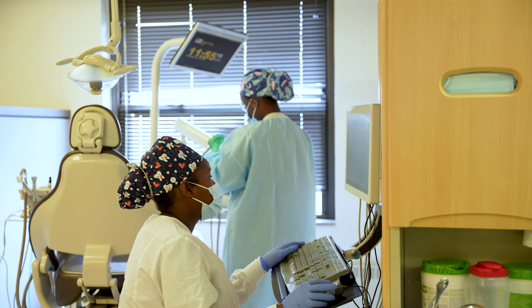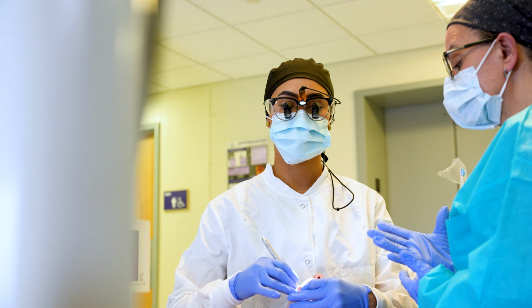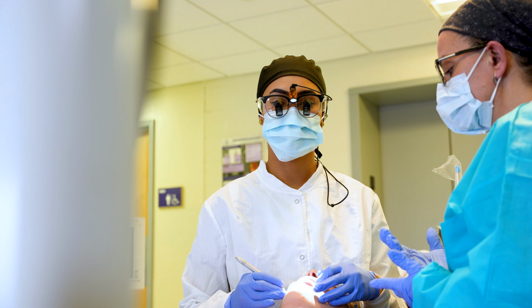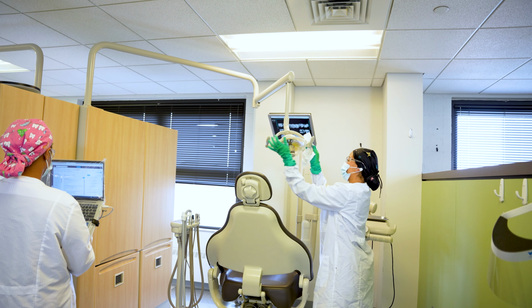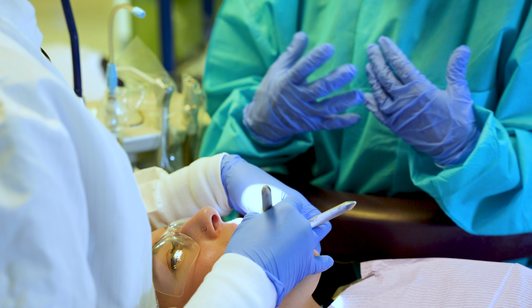We are the only and the first program in the country to include teledentistry and this equipment in our education curriculum. After COVID, there was, I don't know if it was just a fear of the dental office in general, or if it was patients, and their fear to venture outside and go back to real life and the way things were. So we purchased the equipment to get out into the community and to treat the patients where they were at, as opposed to making them come to us. We've been to school settings, we've been to outreach programs, so it just allows us to get out into the community again and bring the equipment to them, and no barriers that way.